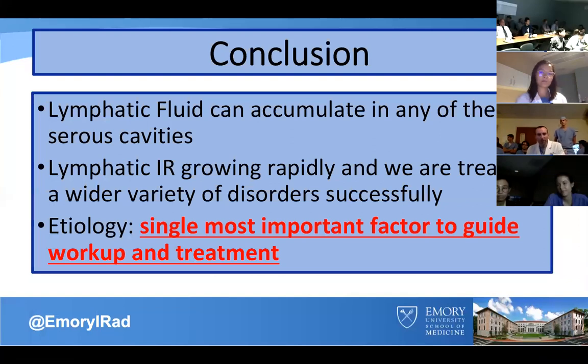More often than not, if it's a lymphocele now, I'll do the alcohol and I'll do a lymphangiography on that laterality and attack it from both sides. I'll do the lymphangiography while I'm letting it dwell. So I'll just inject the alcohol and let it do its thing.